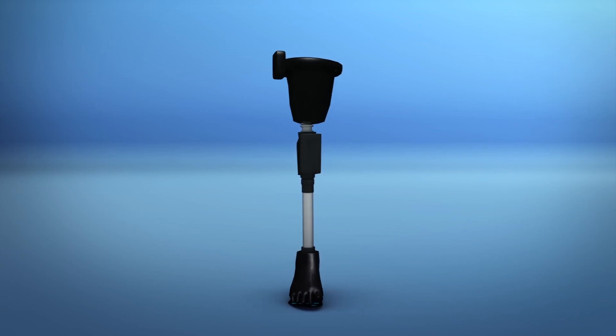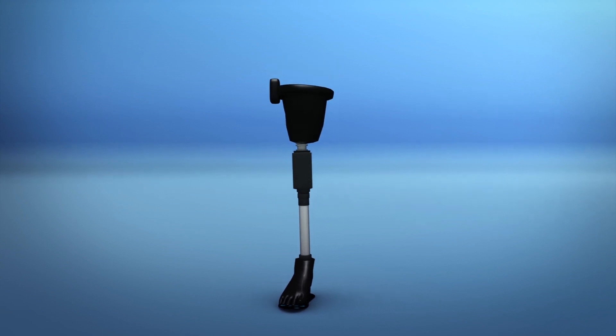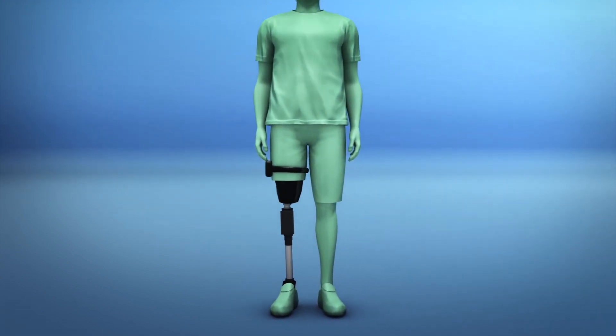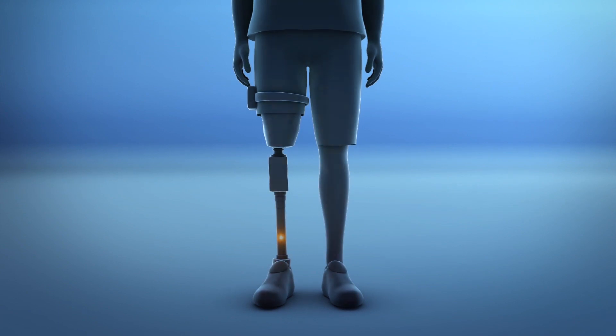Researchers from the Swiss Federal Institute of Technology Zurich, or ETH Zurich, and several other European universities collaborated to create a leg neuroprosthesis that sends sensory information to nerves in amputees' leg stump. A study published in Science Translational Medicine detailed the researchers' findings.